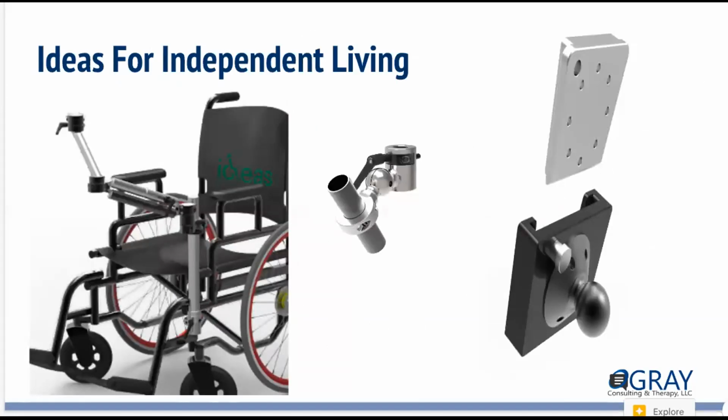And then Ideas for Independent Living is out of Canada. They're a really wonderful group. They will do lots and lots of custom work. They have a gas spring based wheelchair mount, which I really like for non-tilting wheelchairs. And it allows really quick, easy height adjustment of the mount, and it swings in and out nice and easily for users that are doing it independently. It's a really wonderful option.